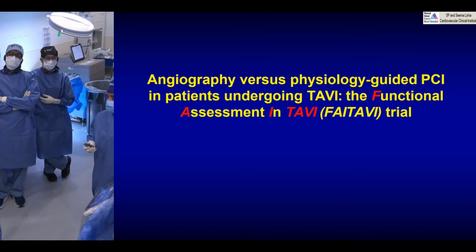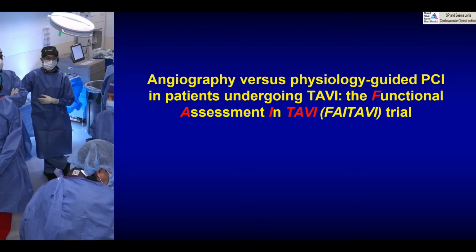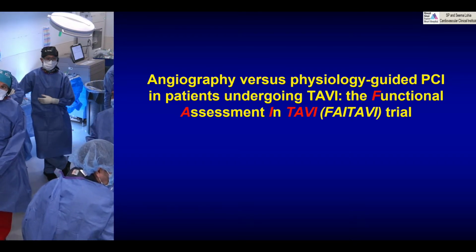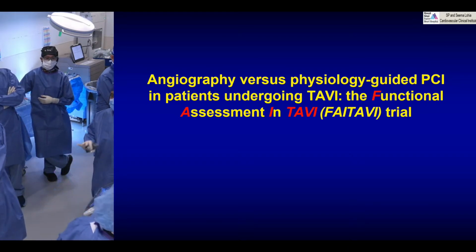People used to think about doing the iFR, so you don't give adenosine. And there have been a lot of data when this trial, called FAITAVI, was being planned. At that time there were discussions about both FFR and iFR. But later on, after some experiments, the investigators decided that they were going with the FFR only.